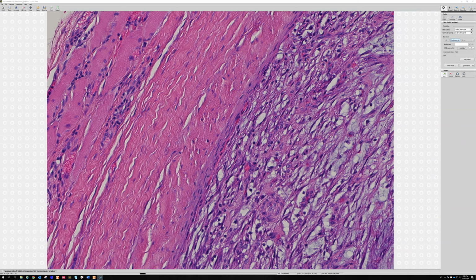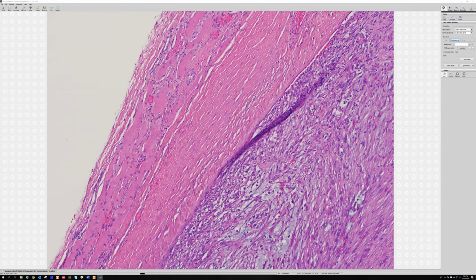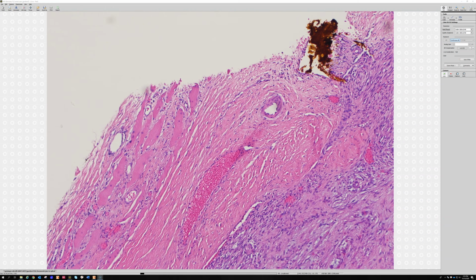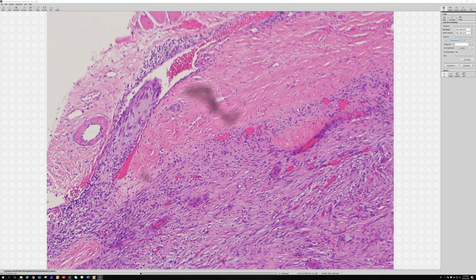So often, you don't have to see the fascia there. It depends on if they've sampled it or not. But usually when nodular fasciitis grows on the fascia, it does one of 3 things. It can either make a nodule that pushes up into the subcutis, or it makes a nodule that pushes down into the muscle underneath, or sometimes it grows linearly out along the fascia and kind of sends little spikes or little feet up into the subcutaneous septa, and it kind of stretches in and looks kind of spiky and irregular. That's called the fascial pattern because it grows along the fascia. So that's good nodular fasciitis tips.